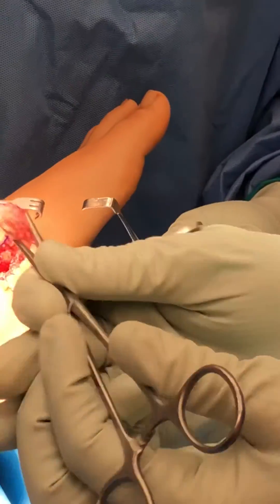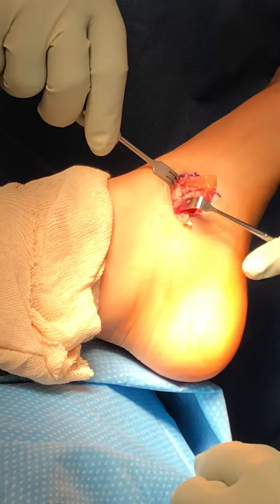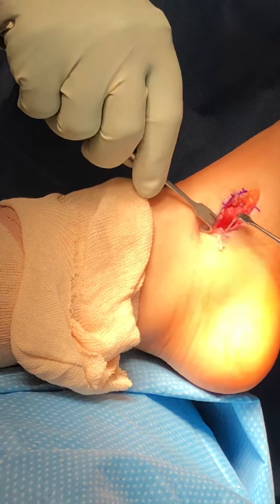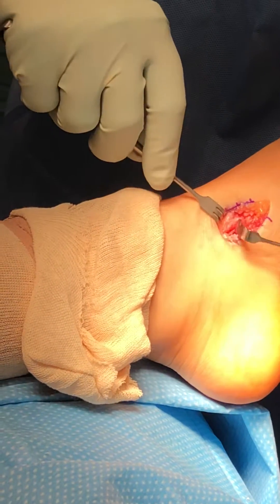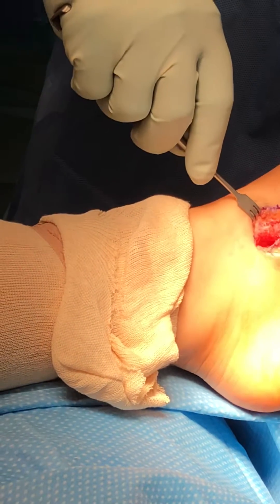All right, that is the extra accessory navicular bone, removed off the navicular tuberosity. We will clean this area up here, which has extra hypertrophic bone on the navicular. We'll smooth that off, then take our tendon back and reattach it via an anchor into the bone to maintain stability and long-term attachment and strength.